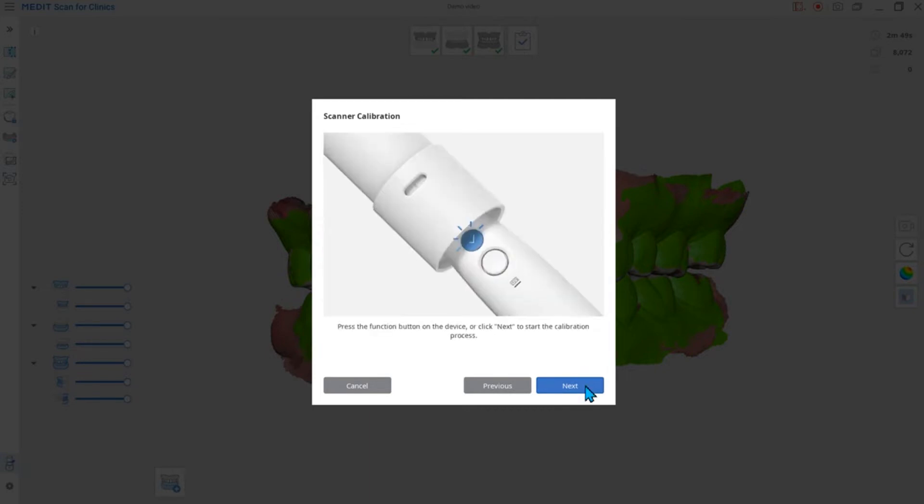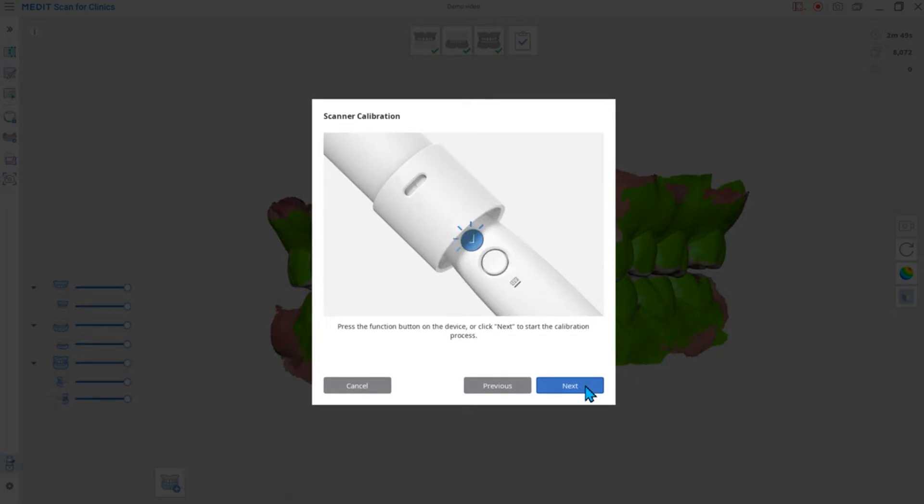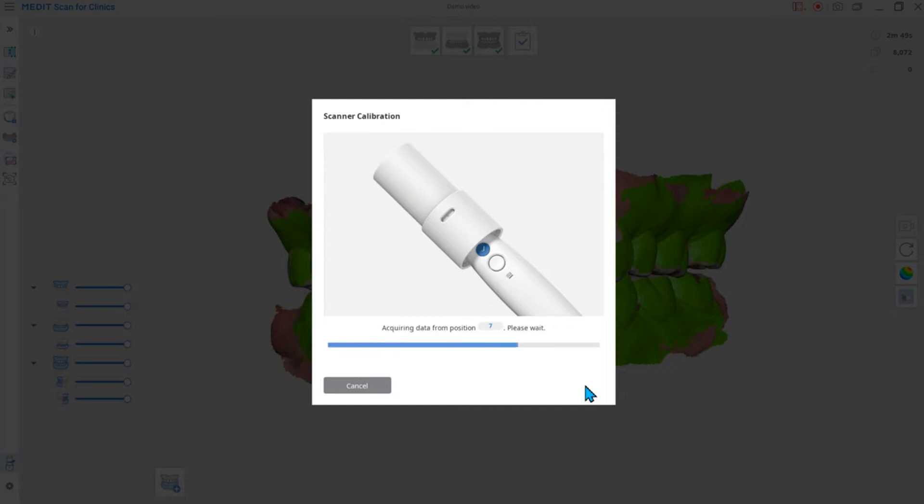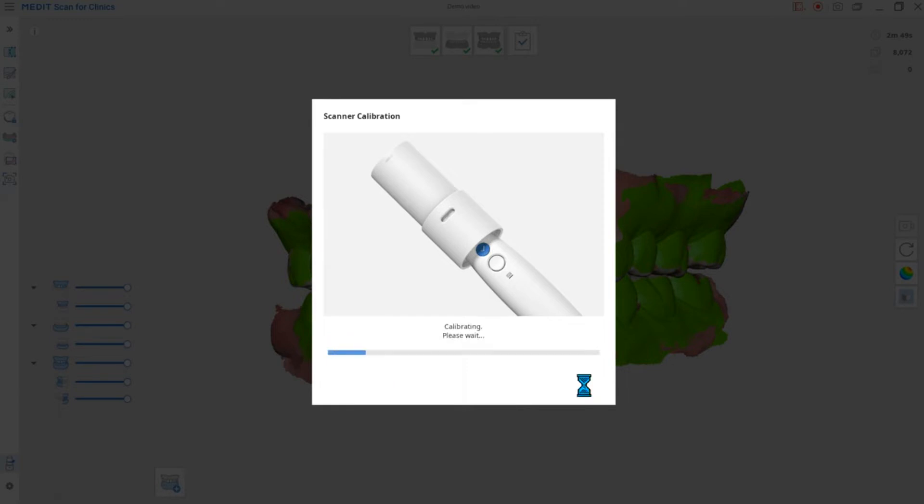Make sure you start with position 1. Repeat the process from position 2 to the last position. Once the data acquisition is complete at the last position, the system will show the results.